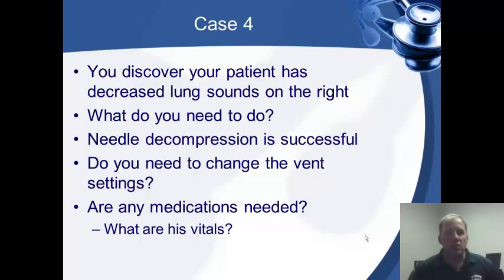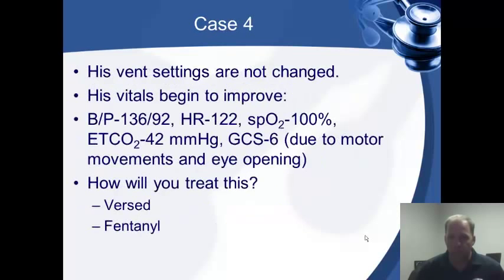This patient's decompensating quickly, getting hypoxic and also hypotensive. A needle decompression would be the optimal treatment for this patient. So do you need to change the vent settings? Are there any medications needed? You need to check his vitals. His vent settings don't change, decompression would be successful, and that would help us inflate that right lung.